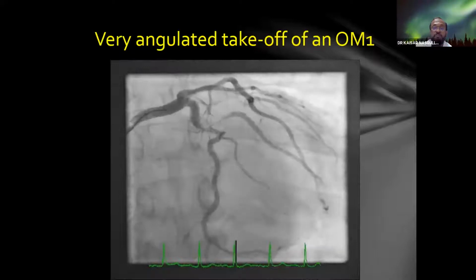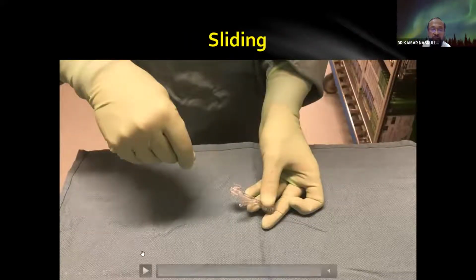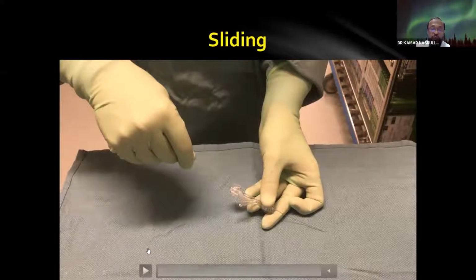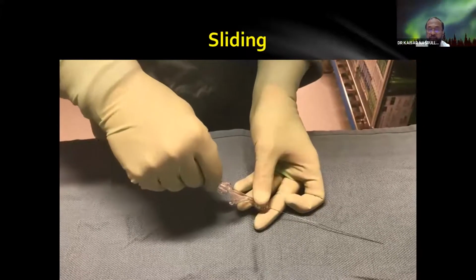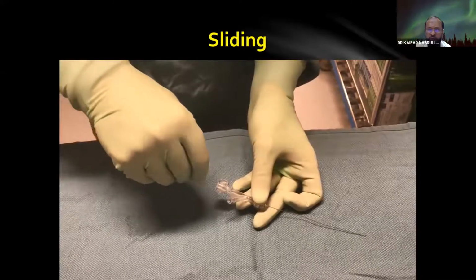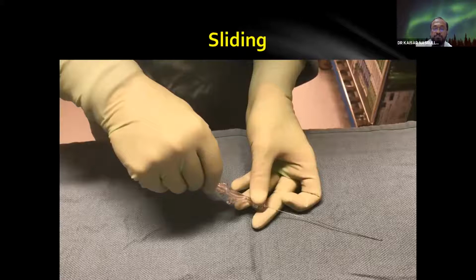Next is the sliding method. Sliding means you just slide the wires. This is usually used with Fielder XT, XTR wires or Whisper wires. Just slide. You see the channels. There are these small micro channels. You slide through them very softly, don't push very hard.